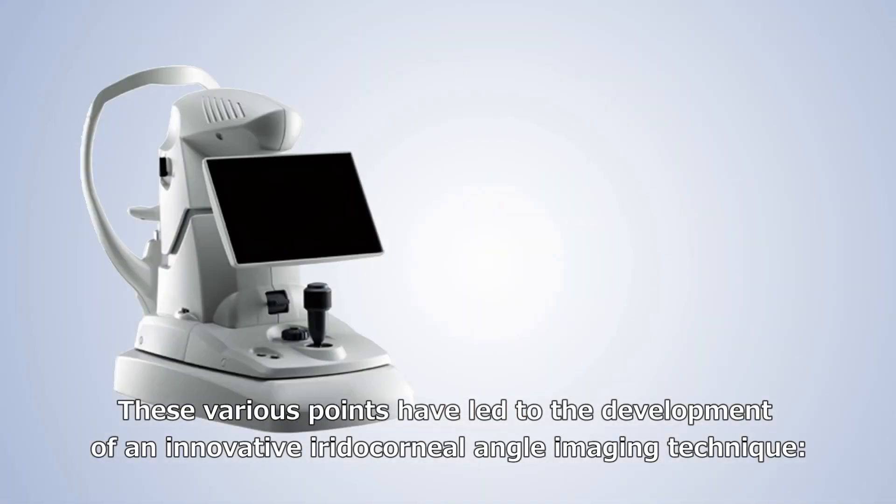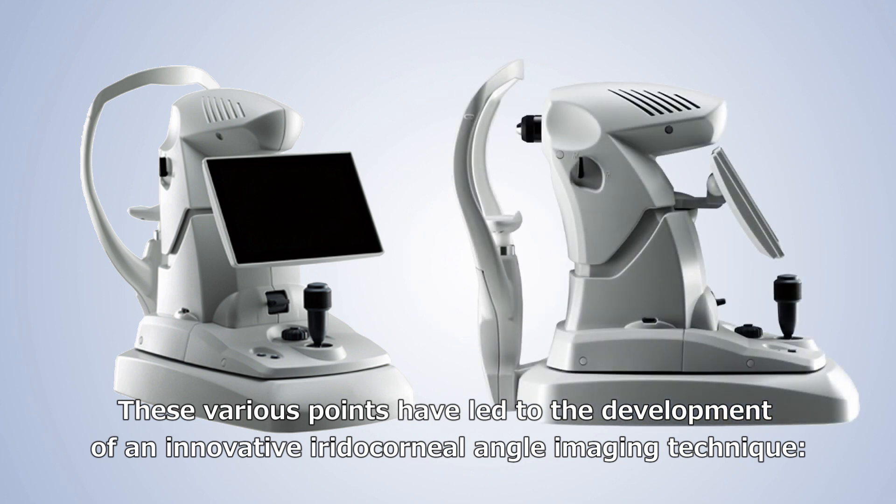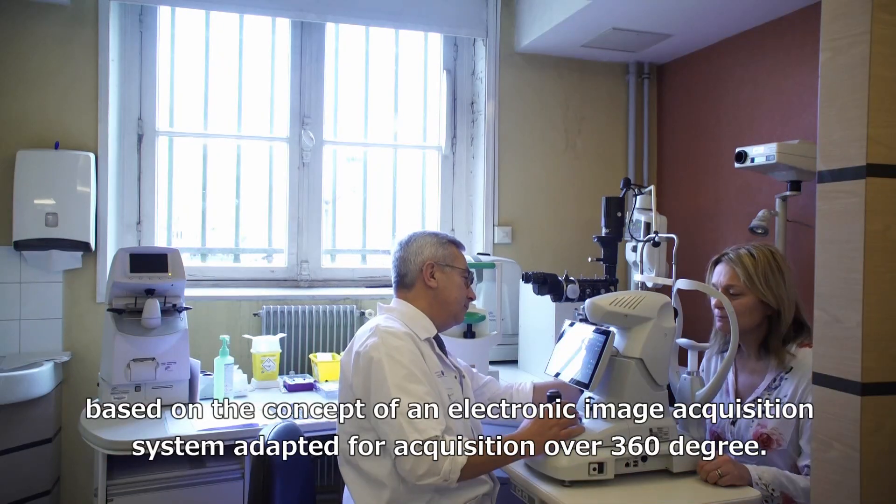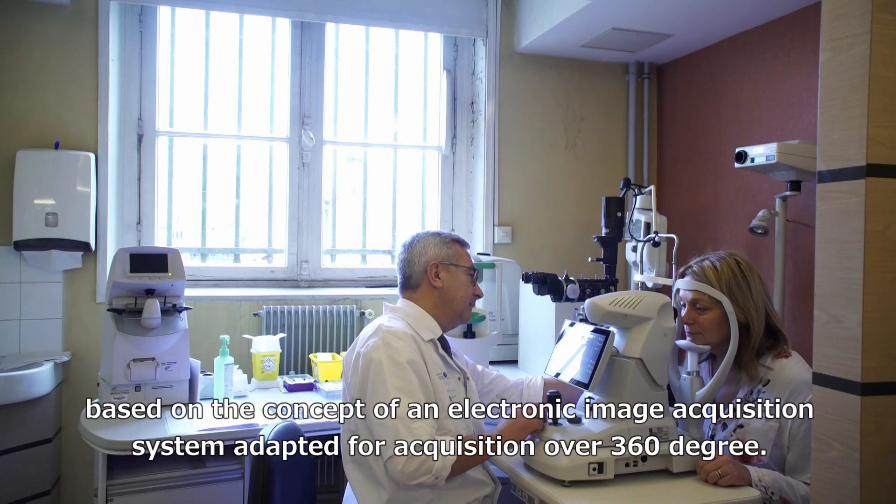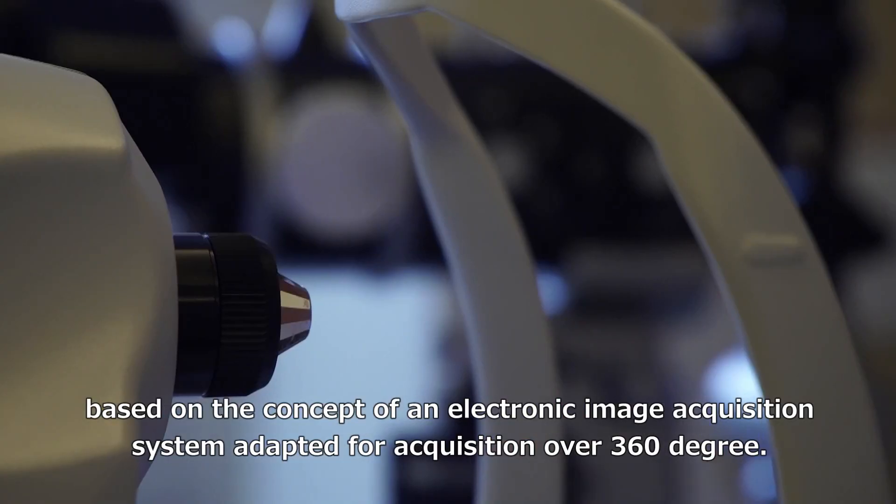These various points have led to the development of an innovative iridocorneal angle imaging technique, automated gonioscopy, based on the concept of an electronic image acquisition system adapted for an acquisition of 360 degrees.